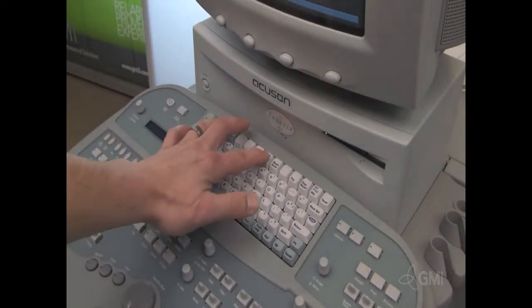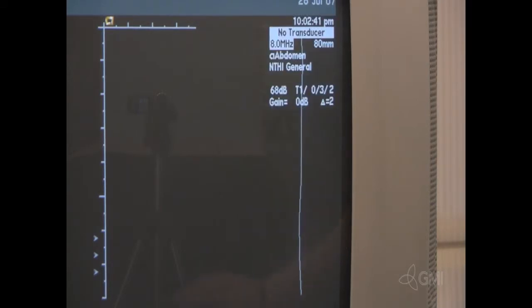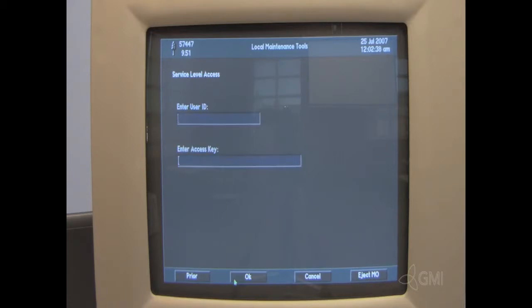Press the setup button and select Service UI. Select Administration. Then select Access Service Level. Then select OK. Enter the user ID and enter the access key. Select OK.